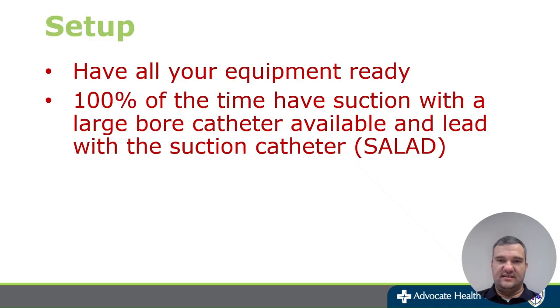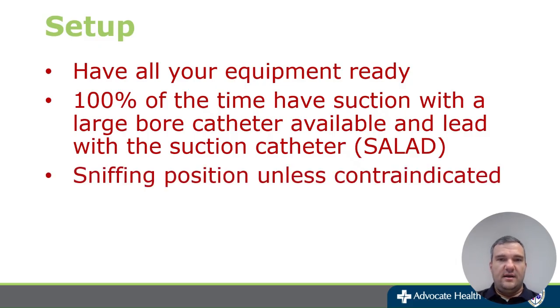You can do the SALAD technique. You can suction before you go in. But leading with the suction catheter, i.e. the SALAD technique, is definitely appropriate to clear the airway of any vomitus or blood or anything else that may be in there, which will increase your success. And then using this technique as well helps you to get a tracheal intubation, because if the suction catheter is placed by the esophagus to suction any of the vomit that's coming, that is giving you a bumper to prevent the ET tube from going down into the esophagus there as well.